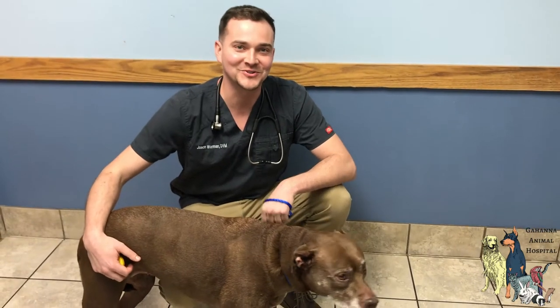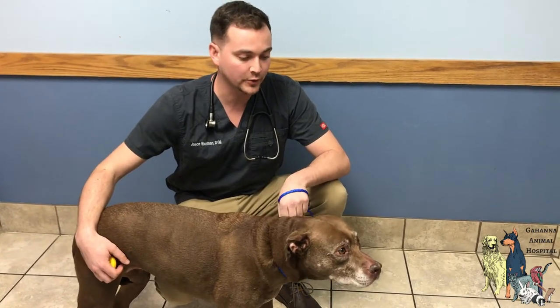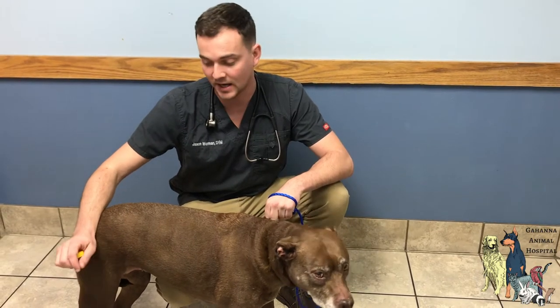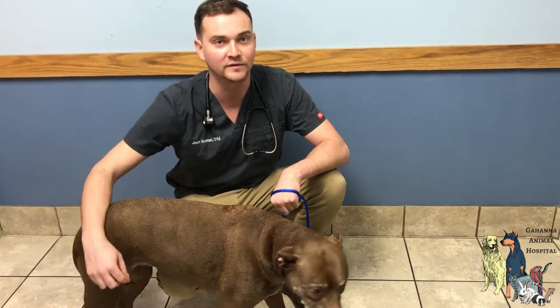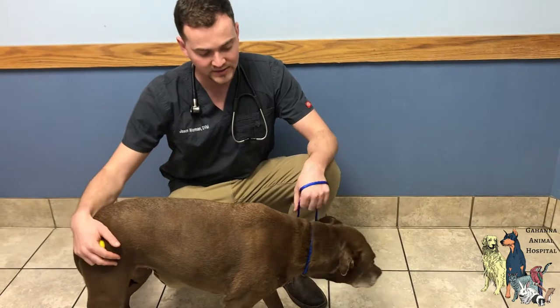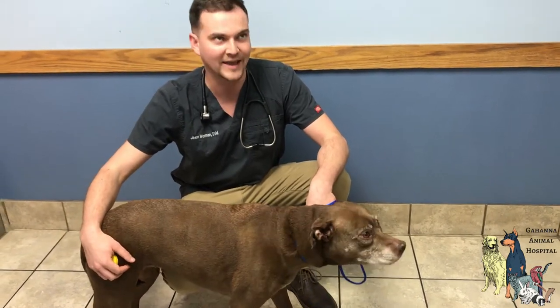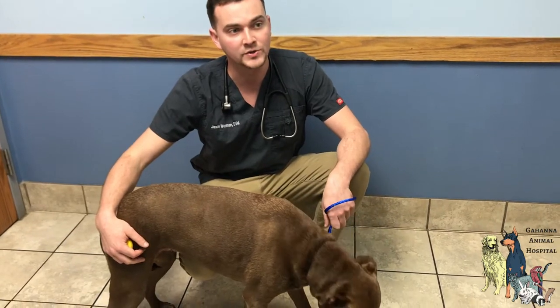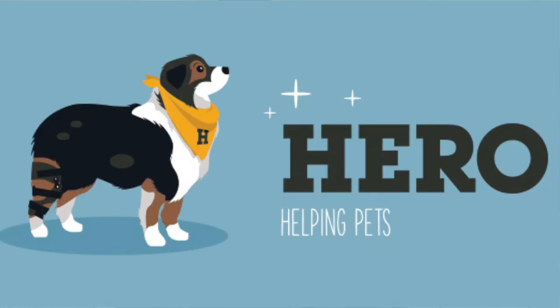Hi, I'm Dr. Jason and I'm here with Georgia today. Georgia is a 12-year-old pit bull that has a torn cruciate ligament. That is a knee ligament that's important for normal walking, and she's a little bit older to be a candidate for surgery, so we have decided that we are going to try a knee brace and we're using a company called Hero Pets.